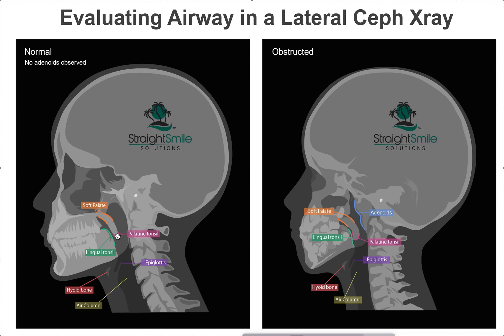The palatine and lingual tonsils can be seen clinically — usually the palatine, not as much the lingual — but you can definitely see the lingual in the lateral x-ray. If you want to see the oral airway going down, you should be able to see some daylight right here, but you can see it's almost nothing there. Here you can see a little daylight going down, but here it's touching. You can also check your Mallampati score clinically by saying 'ah' and using a tongue depressor.